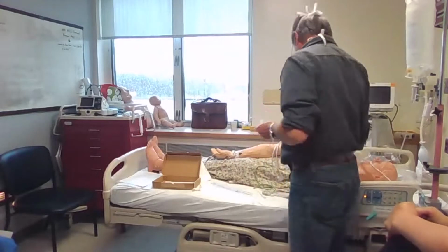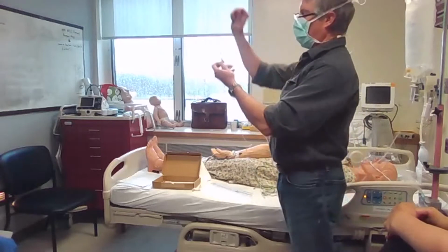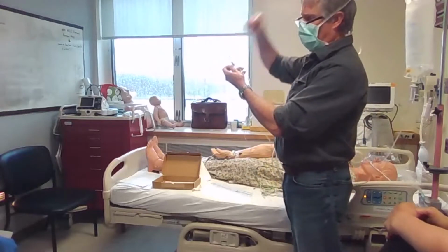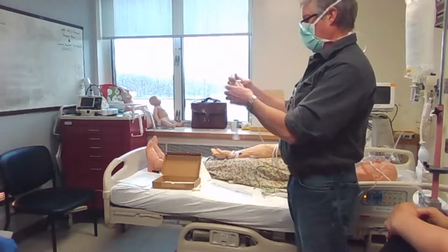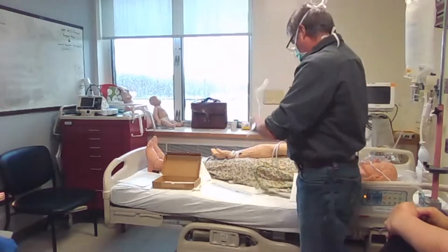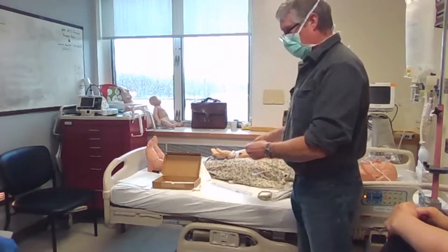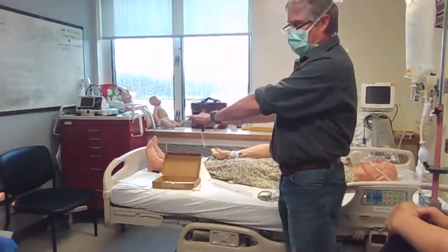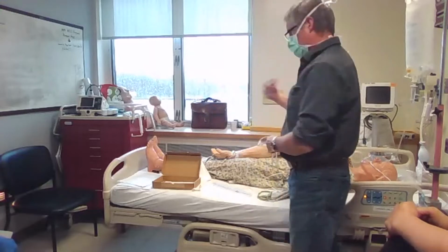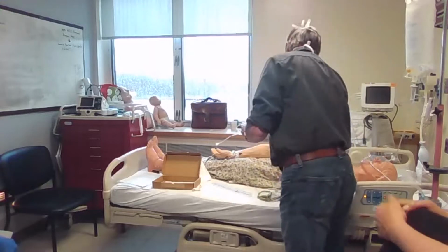It is a very compliant, flexible diaphragm that sits between the pressure in the tubing that's coming from your reservoir bag and the pressure on what we call the patient side. The easiest way to identify it is the patient side. I'm going to refer to this from now on as the patient side of it, because it's a mnemonic that helps me remember things.